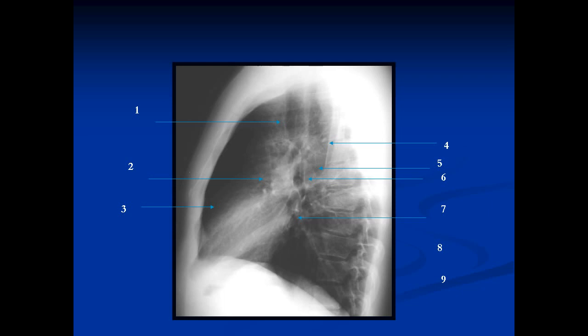The left atrium is the part of the heart that sits here, and all the pulmonary veins form a confluence that comes into the left atrium at that level. Finally, we have the left ventricle, which sits in the lower part of the chest. Now you have to look at the diaphragms. The right diaphragm is the one that goes all the way to the front. The left diaphragm comes to the front but stops at the level of the heart — the reason we don't see the anterior aspect of the left hemidiaphragm is because the heart sits on top of it and there is no air between the diaphragm and the heart.